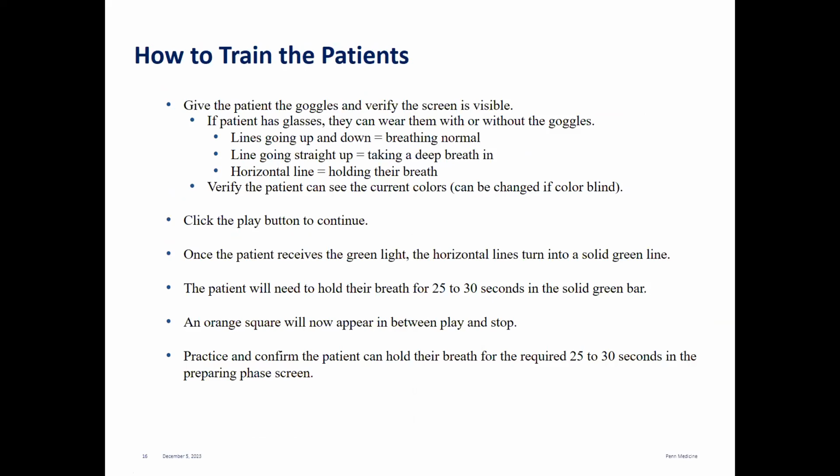So once you establish that level, you're going to give the patient the goggles and make sure that they can verify everything on the screen. You want to explain to them everything that they see. If the patient does wear glasses on a regular basis, they can use glasses underneath the goggles or not use them. It's honestly their preference. The patient doesn't ever have to read anything on the screen. It's just they have to be able to see the colors and the lines.